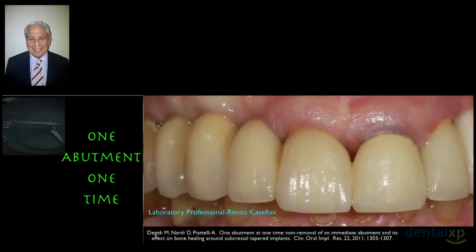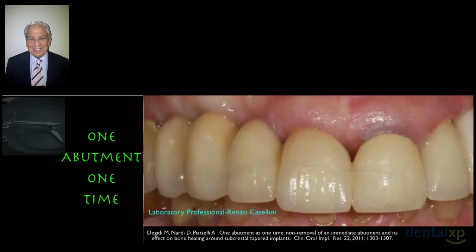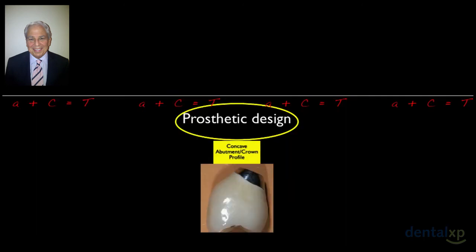So when we start off with a situation and wind up with a situation like this, that preformed abutment was a big thing. Did the abutment shape the tissue? No, it was just one of the components that gave us the result that we have. And that's the thing that we have to understand.